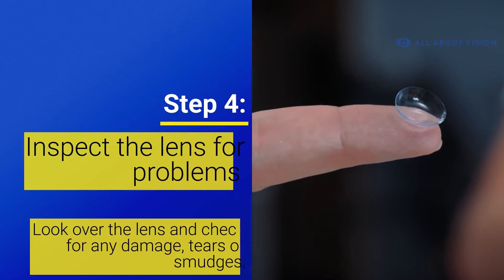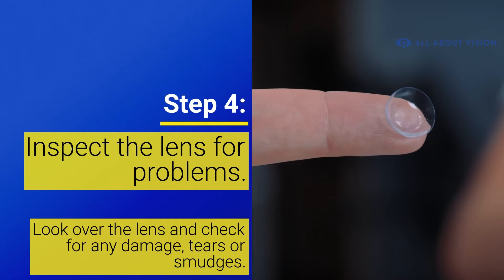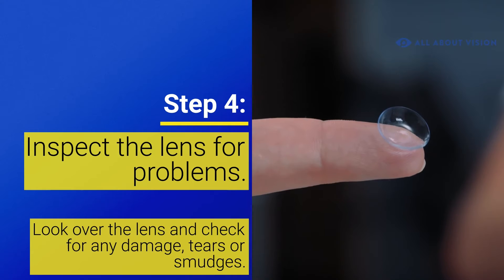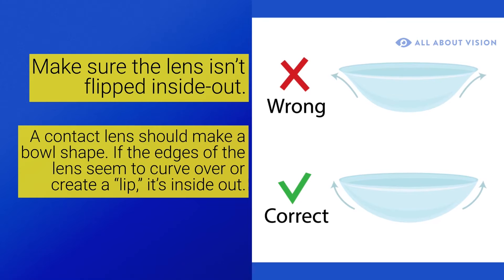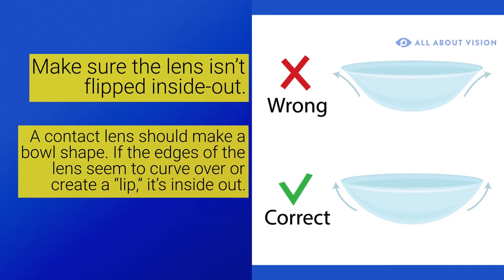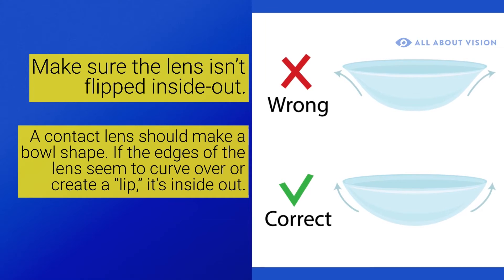Step 4. Inspect the lens for problems. Look over the lens and check for any damage, tears, or smudges. You should also use this time to make sure the lens isn't flipped inside out. A contact lens should make a perfect bowl shape. If the edges of the lens seem to curve over or create a lip, it's inside out. Simply reverse the lens to get it back to its normal shape.